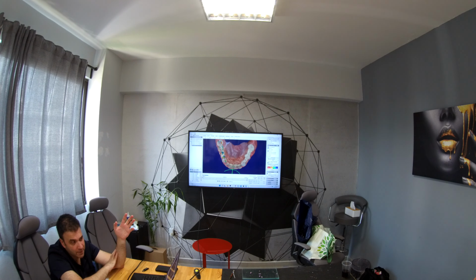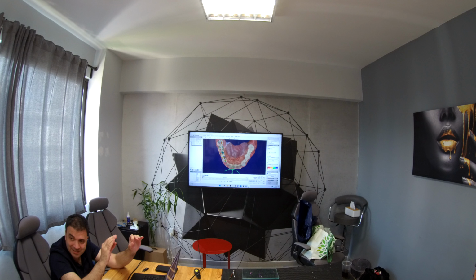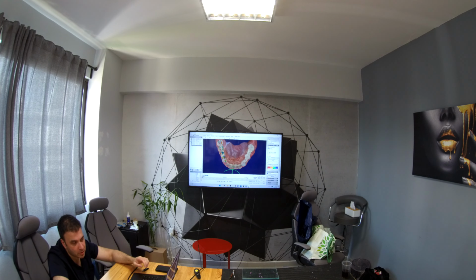But if you see that before you download it. And sometimes it depends if the patient has periodontic problems. Absolutely right, because the patient could just squeeze. Yeah. And because there is slight distortion, and if the scan is very sensitive, it will see it like teeth are penetrating each other. In the real world, I work with it, but if you see that before, it's better to do the rescanning and to do it once again.